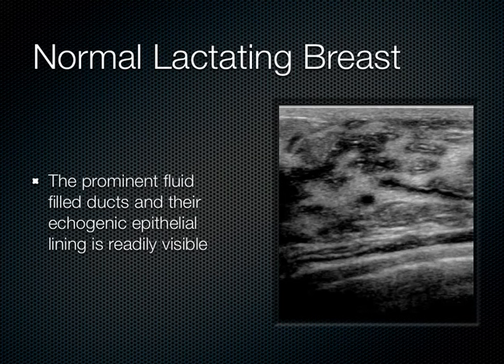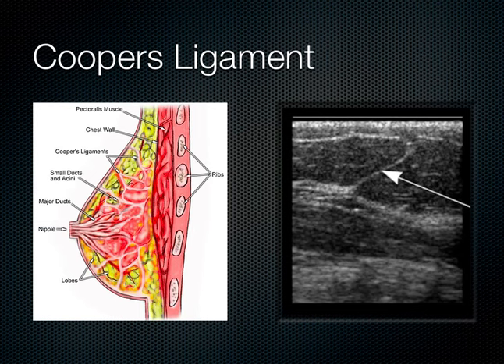In the normal lactating breast, fluid-filled ducts become much more prominent because they're filled with milk. In some of these you can see the epithelial layer very prominently within the ducts. You can also see the suspensory ligaments known as Cooper's ligaments quite easily — they look like hyperechoic lines. When imaged at the right angle, you can see that very obvious hyperechoic line which is Cooper's ligament, seen throughout breast tissue quite commonly.